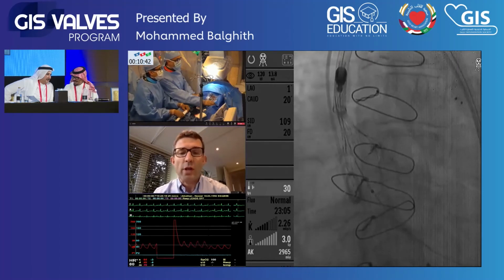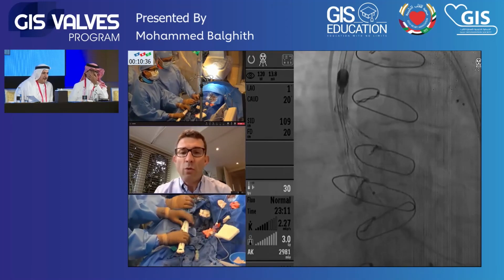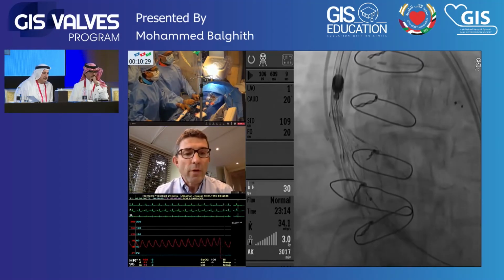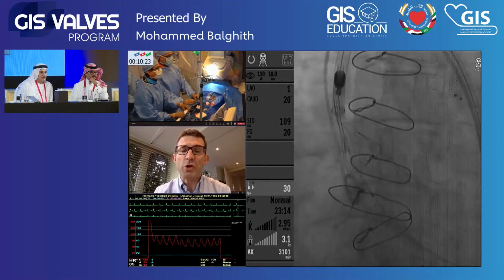So go all the way to the lock point of the valve if you're not already there. I'm there. You're there. Beautiful. Yeah. So now, I would expect the pressure's better. I can't see the hemodynamics, but I would suspect they're recovering. Inject. He has recovered already. Beautiful. It's okay. So I think that is a beautiful position of the valve.